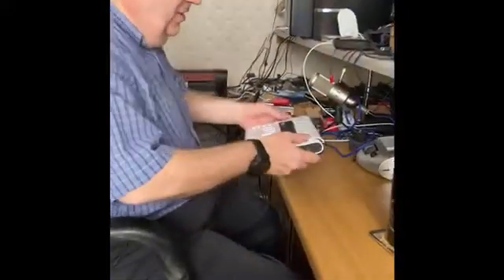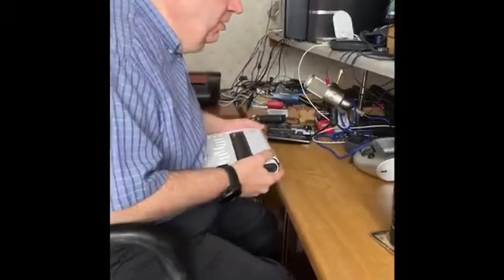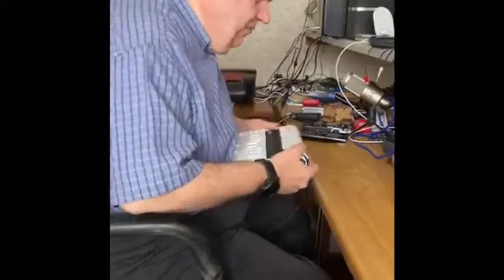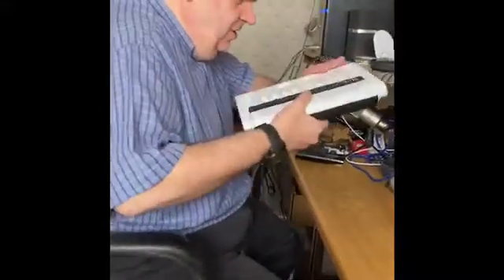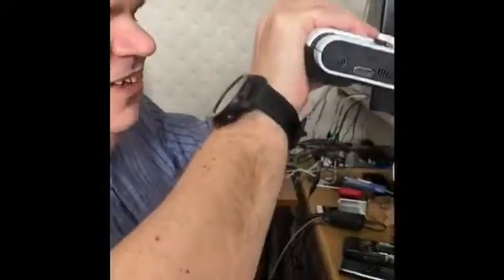So this is a braille note taker, which is basically a laptop with a built-in braille display, which is running on Windows 10. And this is what it looks like. Don't know if you can see that.